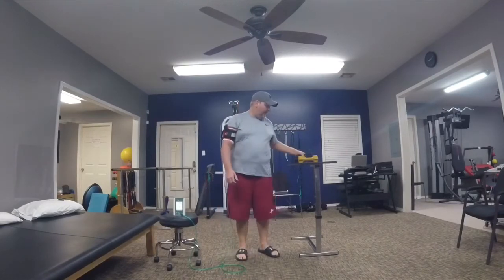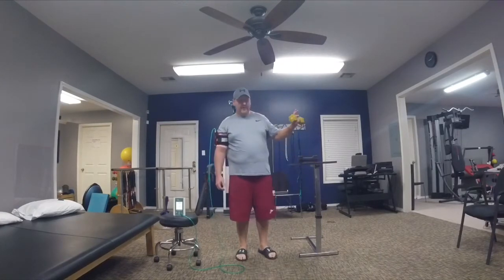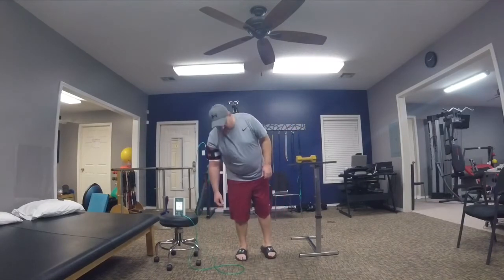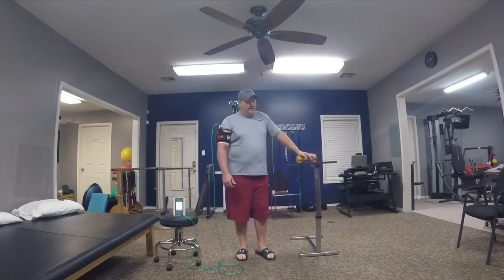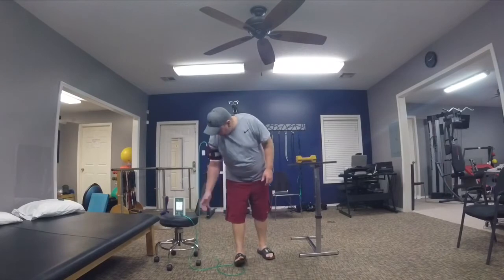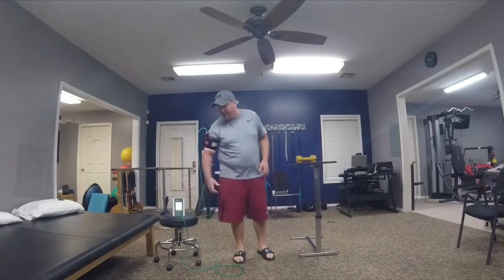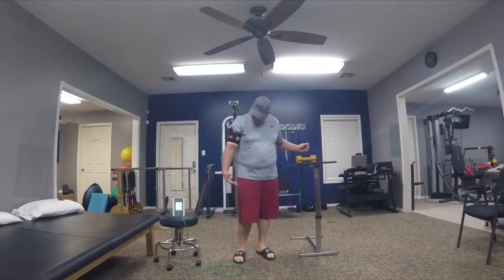See, I wasn't able to do the full 15 on the 10. I had to even go down to the 8, and even with the 8, I could only do 2 or 3 after that. So now I still got one more set of 15 to do. I want to try it with the 8, finish up with nothing if I can't do the 8. And I'm looking at the machine because it's got a timer that's counting down. I'm trying to let about 30 seconds elapse before I do it again.